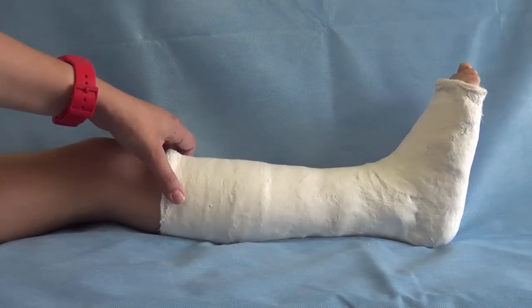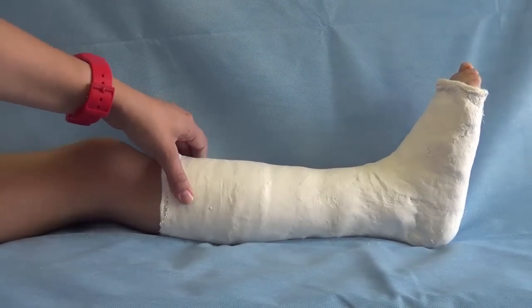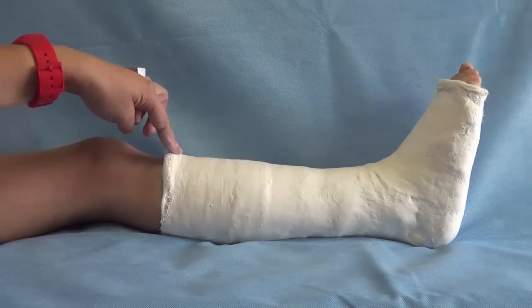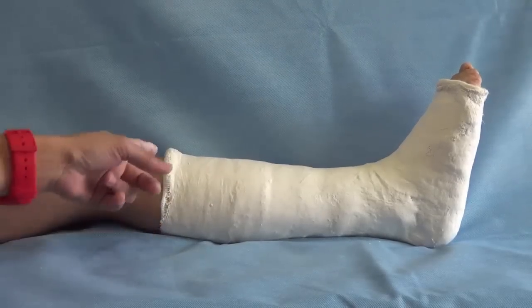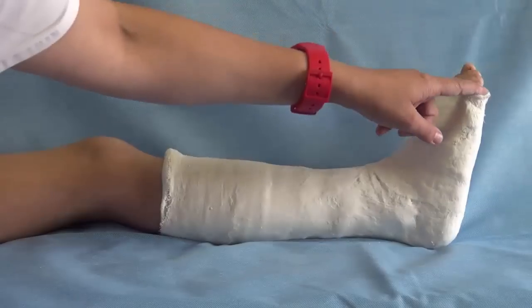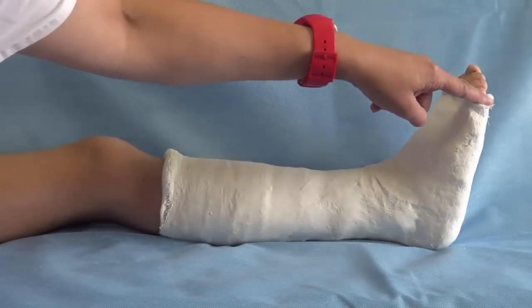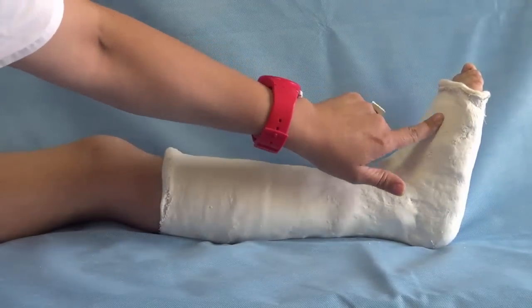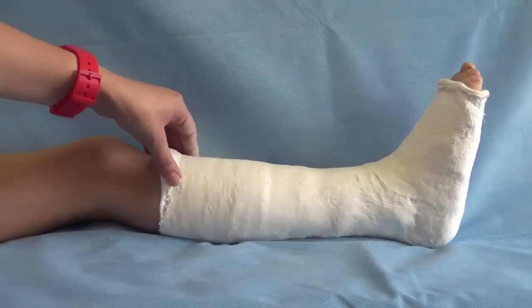This is the final result of a short leg cast. You have the padded shape here. You can also see all five toes, and it's very well molded to the shape of the leg.